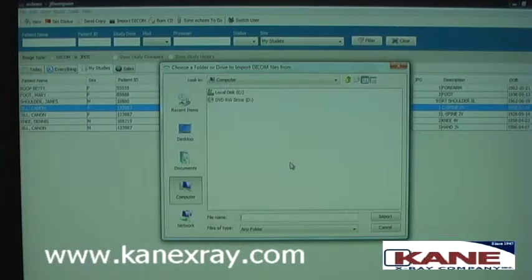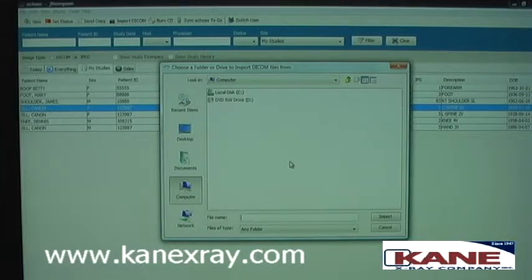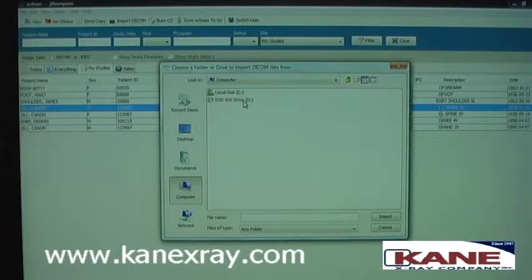It will then ask you the location that you'd like to import from, which is usually the CD or DVD drive.